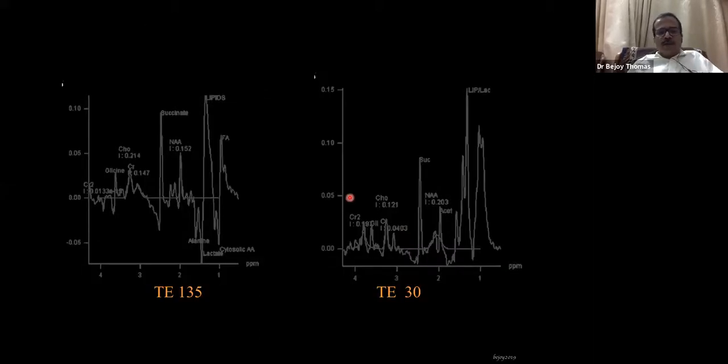But more importantly, what will you get by doing spectroscopy? When you see this, you should especially try to do a spectroscopy before even the first dose of antibiotic has gone. Even after the first dose of antibiotic, the spectrum can change. You have to do both short TE and intermediate TE in these cases, because you are looking at a lot of metabolites.